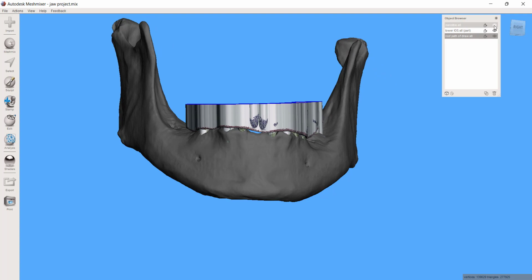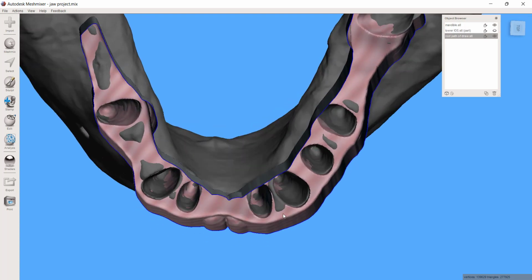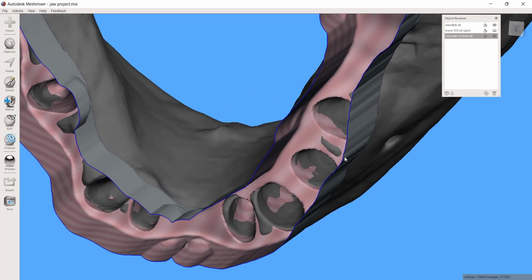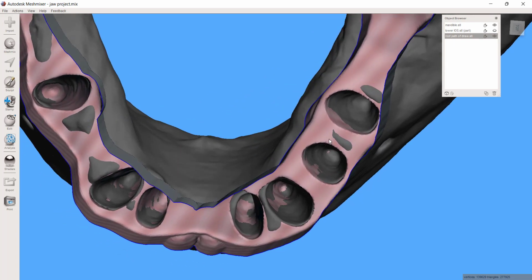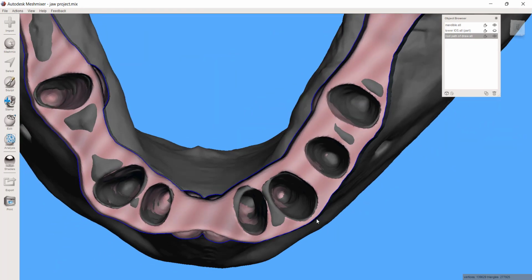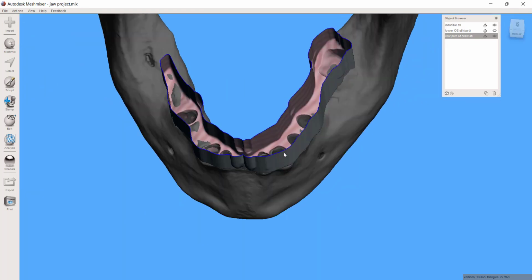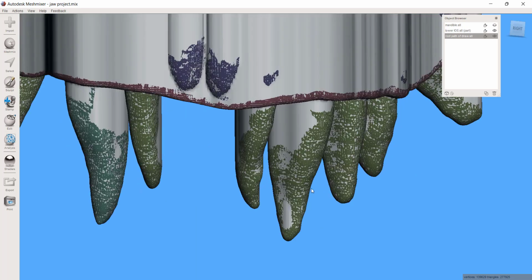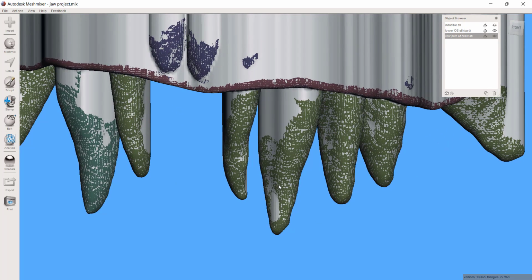So let's now think about making these sockets. When I look from this direction, I can look down in here. If I subtract this from the mandible, I see everything it's going to take away. But now it's a little more complicated than that. There's no offset spacer. If you've ever printed two things, imagine you're printing a two-piece denture, right?